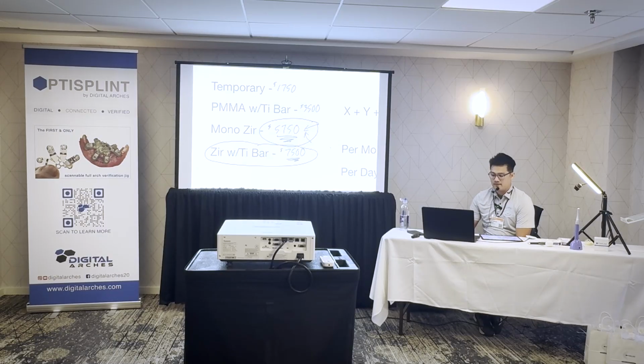Same. Yeah, but I would say 90% of ours, at least on the West Coast, we don't do a lot of FP1s. In my territory, I have a Clear Choice and I have a Nuvia, and most of our surgeons are keen to do less than 6 implants, right? If you look at the literature, there's a survival rate difference between 4 to 6 implants. So 80 to 90% of my cases have 4 or 5 implants.